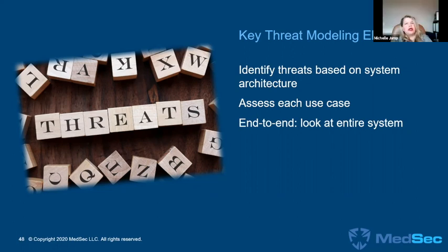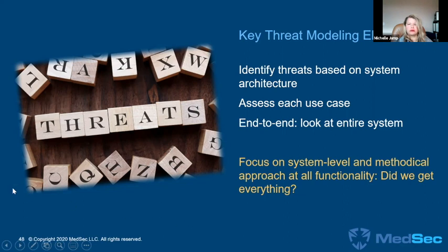So not only is it important you look at the entire system architecture as an overall whole, but it's also important to not just look at what the device's day job is, but also when it goes to the corner store and it does things that are part of its use, but not necessarily part of the primary job. Because sometimes what we see is that threats can emerge through kind of those side activities of maintenance and other things that we want to make sure that we're capturing in the threat model. And that again gives us that concept of thoroughness, that you've looked at everything. So if we're able to apply all that, you can better make that argument that you have hit every point.